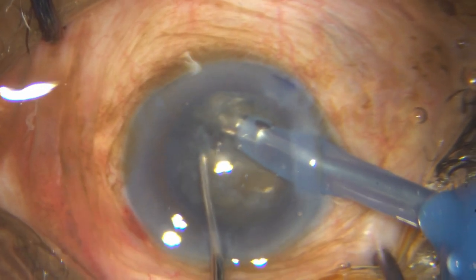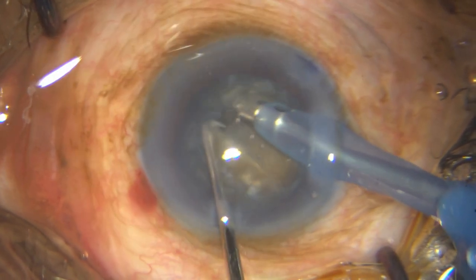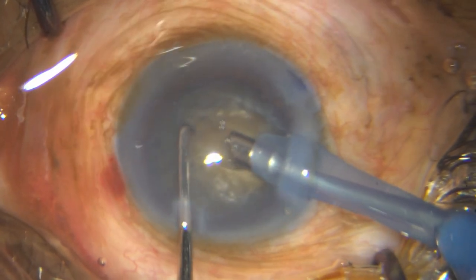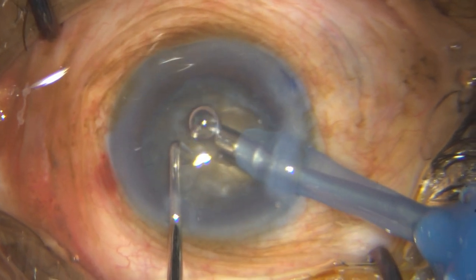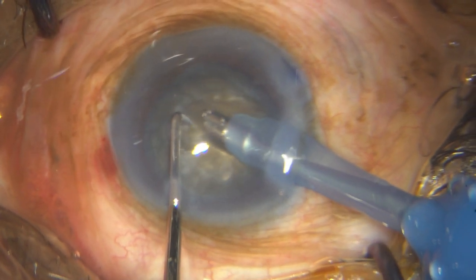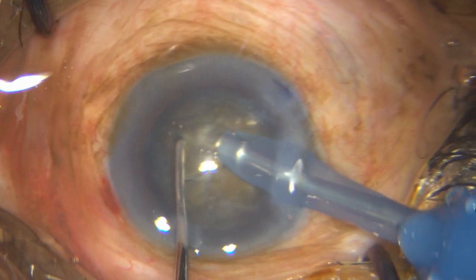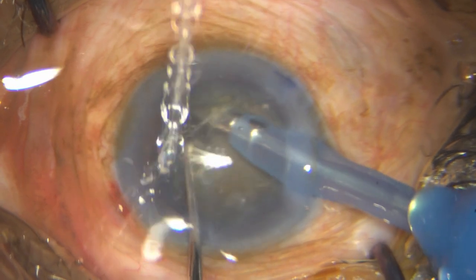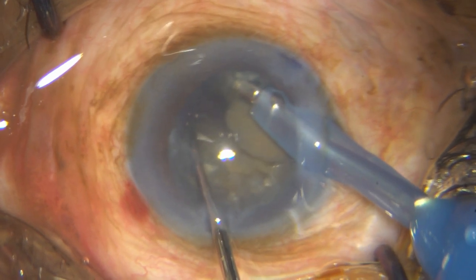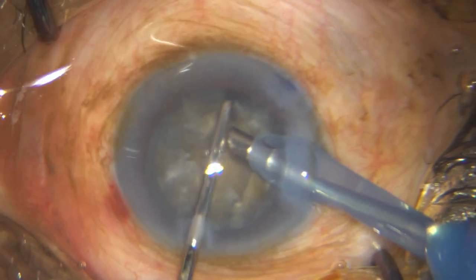You can see that's the first chop. You can expect the spine to be left for a significant amount of time; try to break it — sometimes you just cannot break it. And you can see that disc-like tissue in the center; beneath the disc will be attached fibers of the backbone of this nucleus — this usually happens.